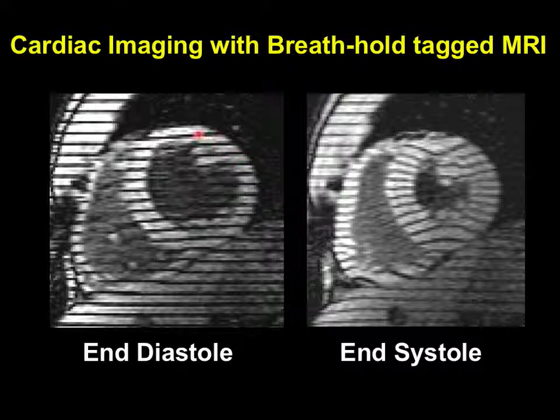And that object has normal signal here, but there are parallel planes running through the whole volume. And in those parallel planes, no MR signal will emerge, right? And the reason for that is just prior to making this picture, we applied effectively a 90-degree saturation pulse inside each one of those planes immediately before making this picture. If you do a 90-degree saturation pulse, the magnetization comes down, it's now zero, crush out the transverse magnetization, and now make a picture. And that will come up as zero. But if you do that selectively, then you get this selective pattern of tags.